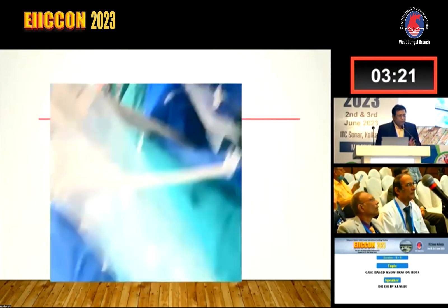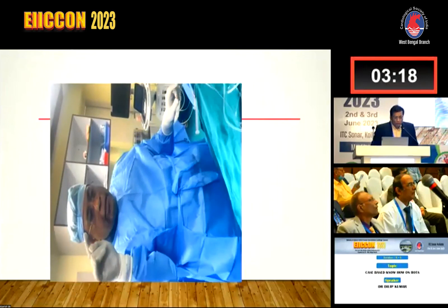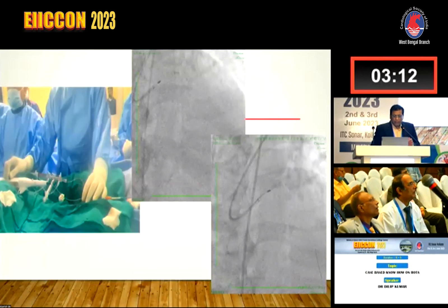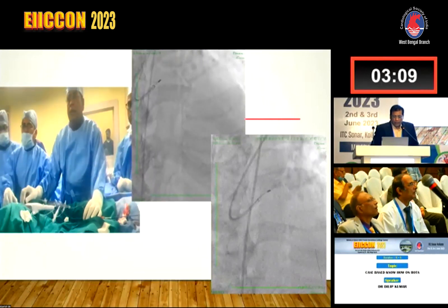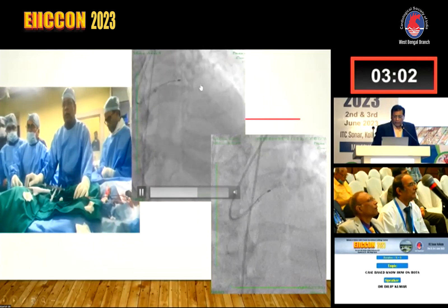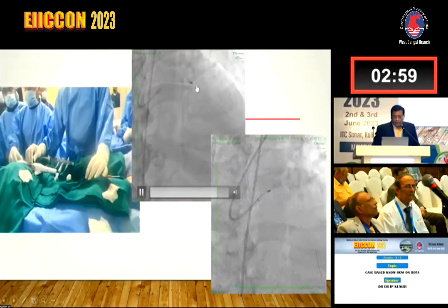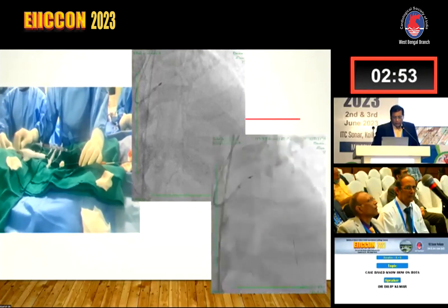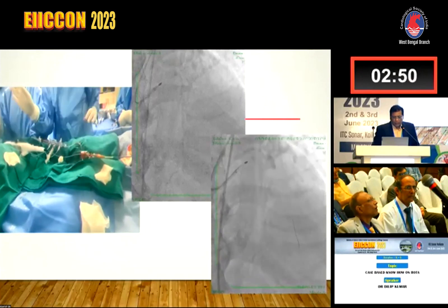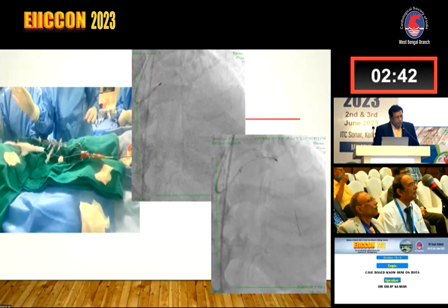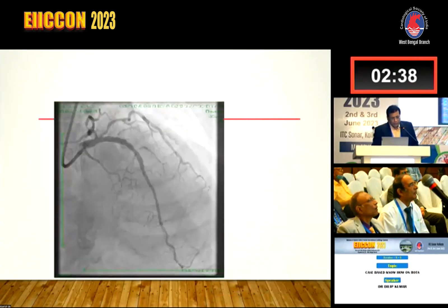Without this preparation you are rushing through the procedure and not doing justice to the therapy. Here you see a very calcified LAD and we are doing rota. The lesion was not getting crossed - everything was getting stuck. We don't have to rush it. On the second run we crossed through, and following a polishing run, the final stenting was completed. This is how rota ablation is done.